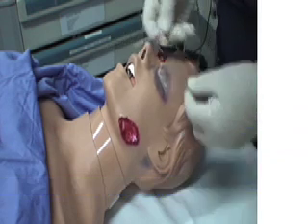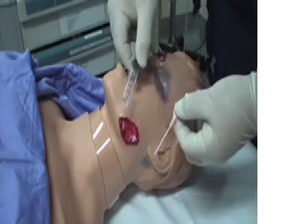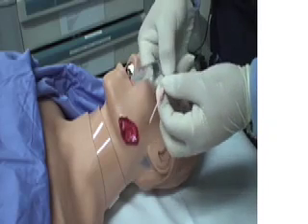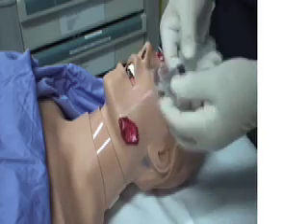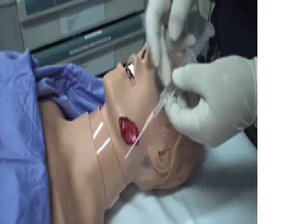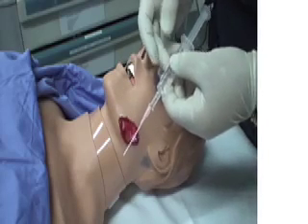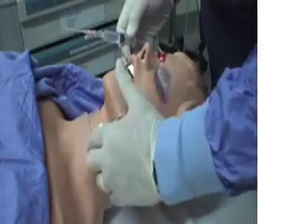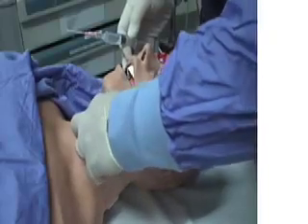Needle cricothyroidotomy is a fairly straightforward procedure that involves the use of a large bore cannula and a syringe usually filled with normal saline or some other clear fluid. The reason we put the clear fluid in is that when we enter the airway, we want to be able to see the bubbling of air coming through there. We then look for the anatomical landmarks, which will be the thyroid cartilage and the cricoid ring, with a small space in between.